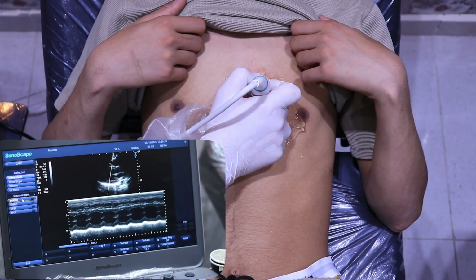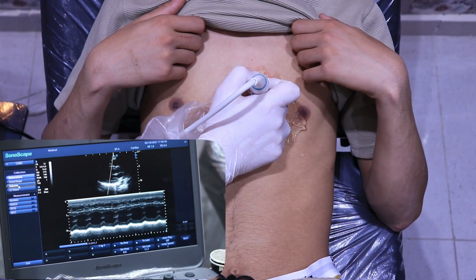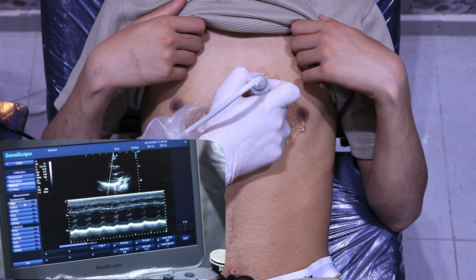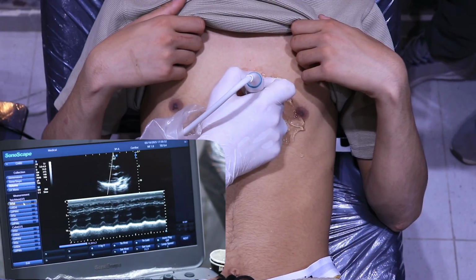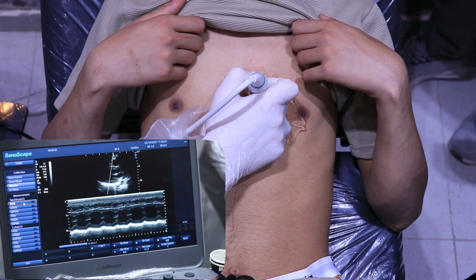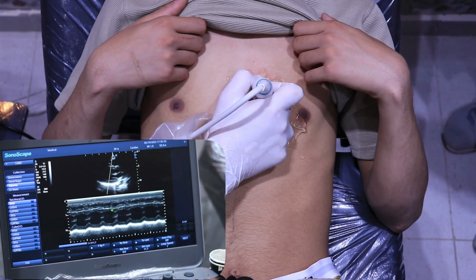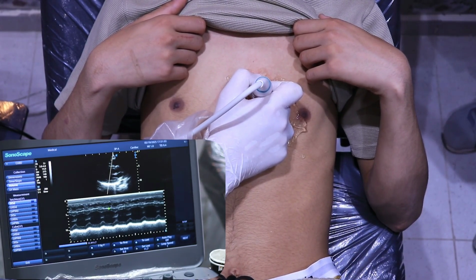If we choose dimensions, RV type, okay. What if we choose volume, for example? All right, so this is basically the ejection fraction. So the ejection fraction is under volume. So the first measurement is IVSD, the septum distance, right? During diastole. So we'll take it during diastole.